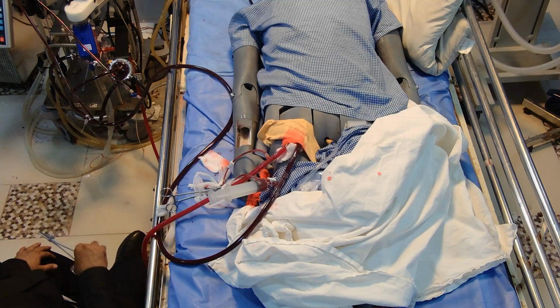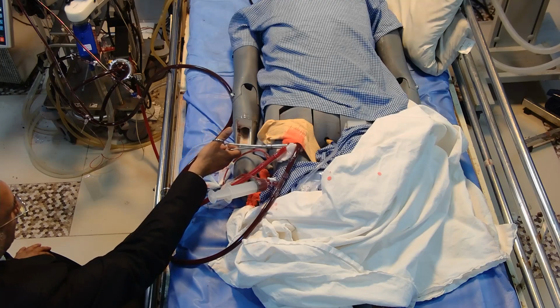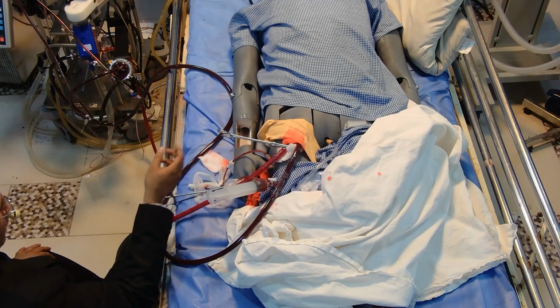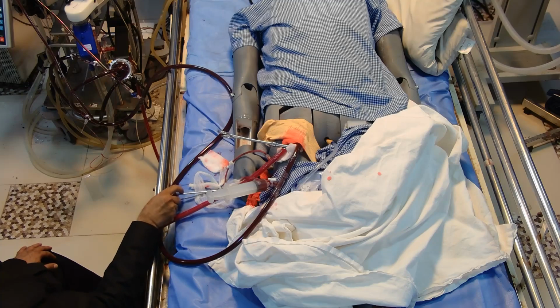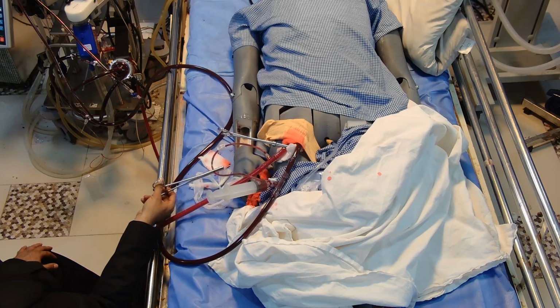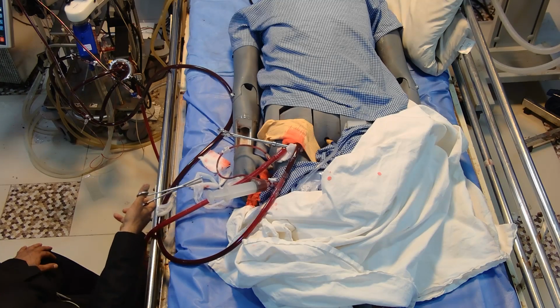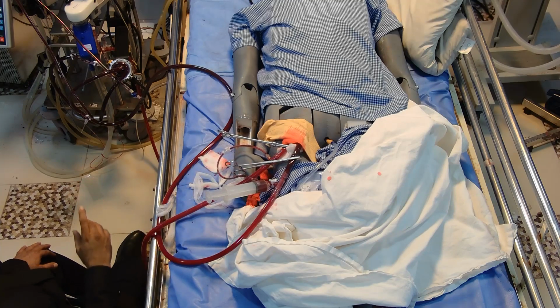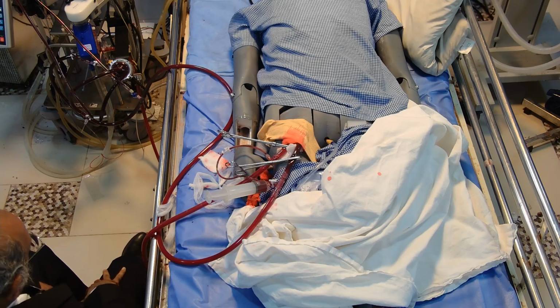When you want to come off ECMO, remember, clamp the return line first, so that there is no question of backflow. Open the bridge and close the venous line. These are the steps you need to follow for the trial of VA ECMO.